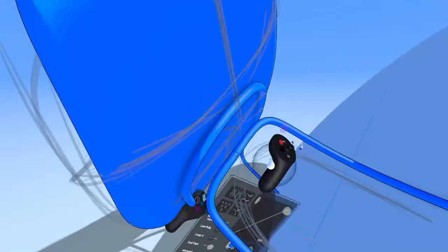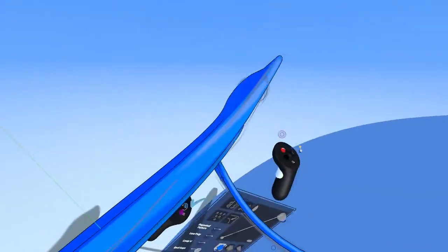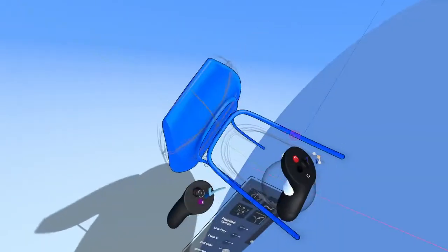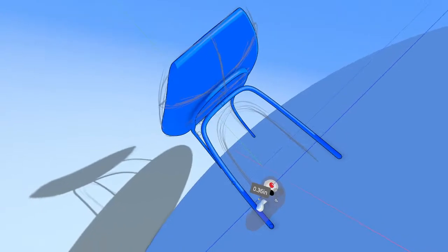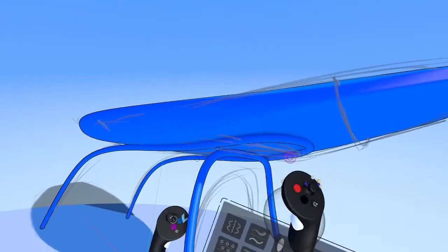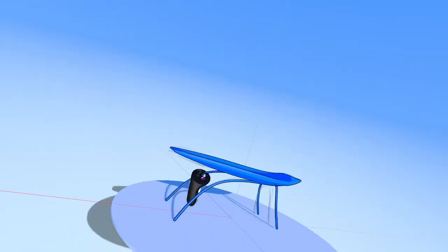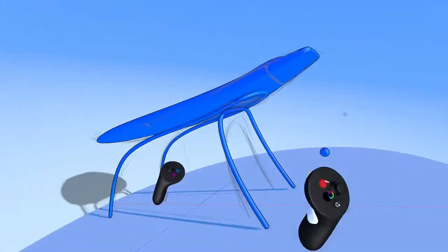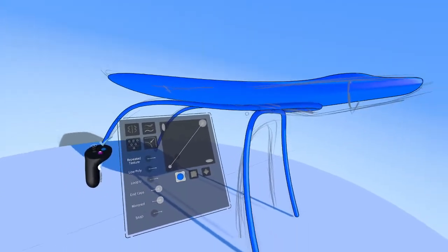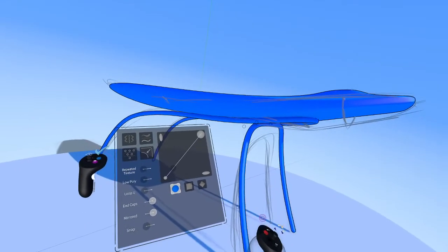Close it off, put it in edit mode, and yeah, so one thing you might notice is that I'm putting a lot of things that I sketch into edit mode, and the reason for that is, at least, you know, this is just for me, I'm sure there are other people that sketch very precisely. I don't find that I can ever make something perfect in the first try in Gravity Sketch. Usually it's a process of sketching something close and then putting it into edit mode and adjusting it. And I found that I like that better because it takes the, I guess, the anxiety of doing a perfect line away, and it's so iterative that I can always put it in edit mode and fix it.